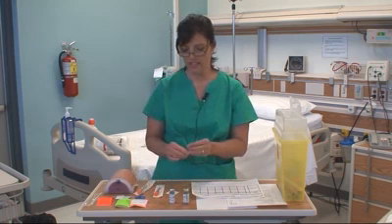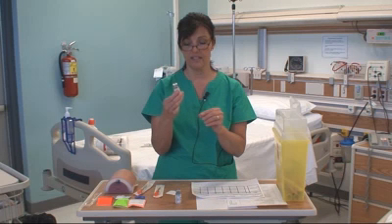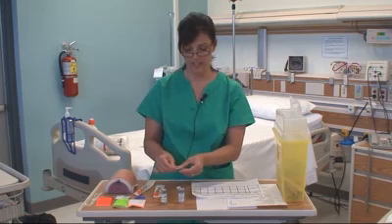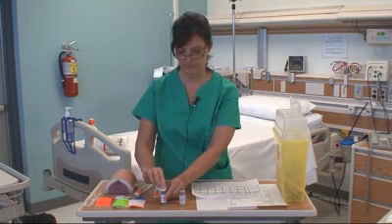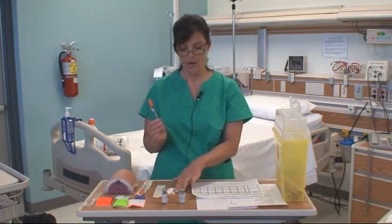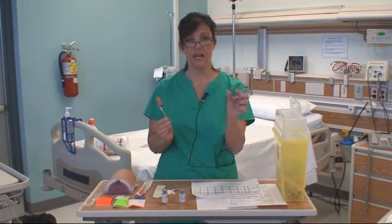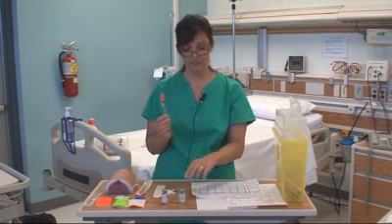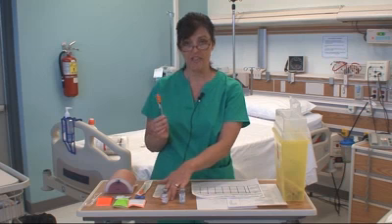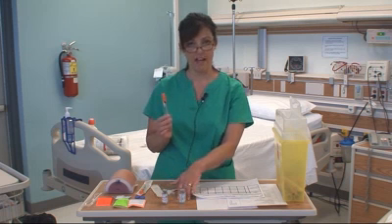Okay, so now when we are mixing our insulin, we have our long-acting insulin, which is our Humulin N, and we have our short-acting insulin, which is the Humulin R. This one is clear, the long-acting is cloudy. So what we're going to do first is wipe the tops of each of the vials. Then when we draw them both up, we always insert the amount of air into the vial first. The amount of air should be equivalent to the number of units of insulin that you're going to remove. We will insert the air into the Humulin N first, the long-acting insulin, and then the Humulin R. Then we will withdraw that amount of insulin from Humulin R and then back to Humulin N.